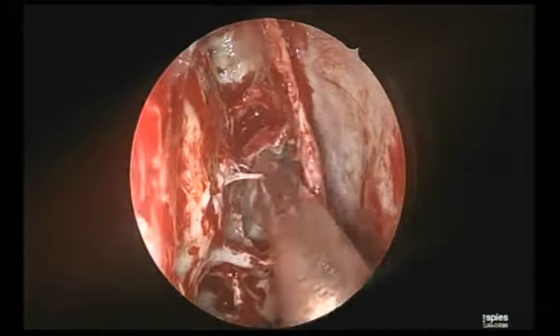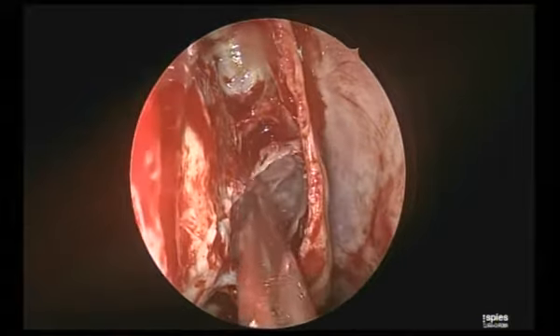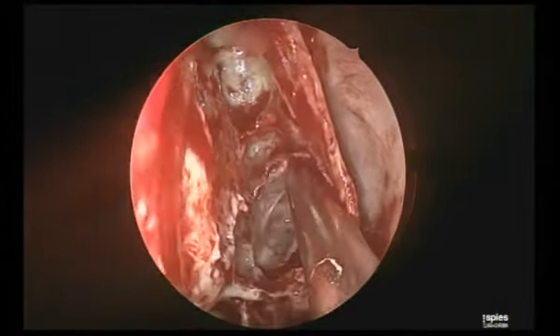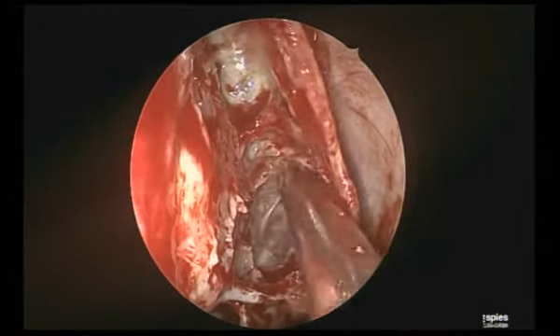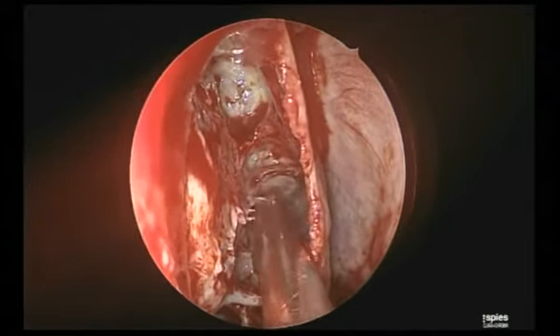See, after trimming this little bit of the superior turbinate, this has never bothered us throughout the surgery. Can you notice that? Yes. So handling the middle turbinate is an integral part of sinus surgery. In over 90% of situations I need to do something with the turbinate.